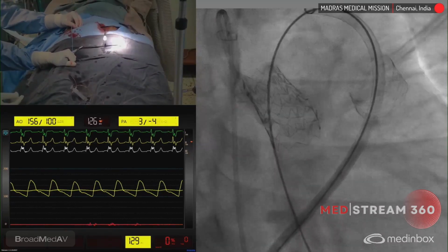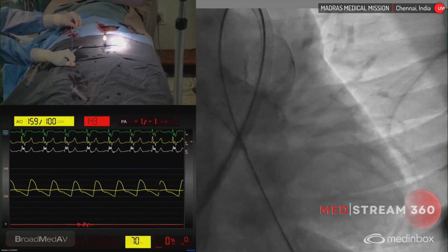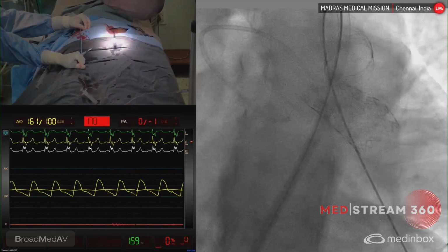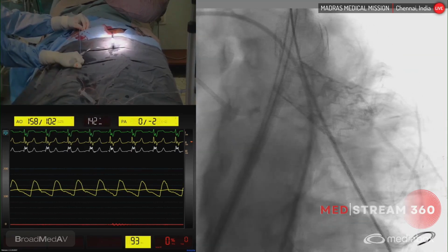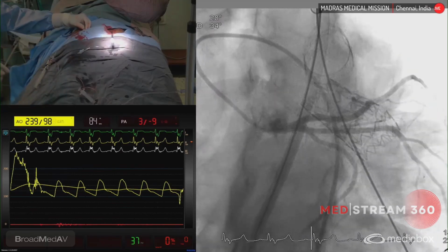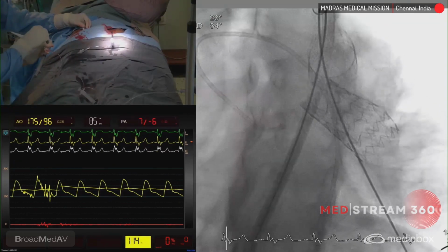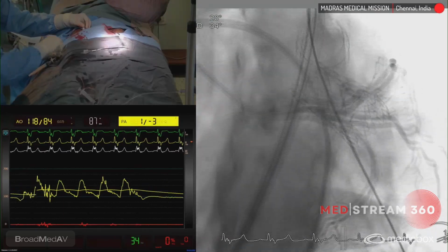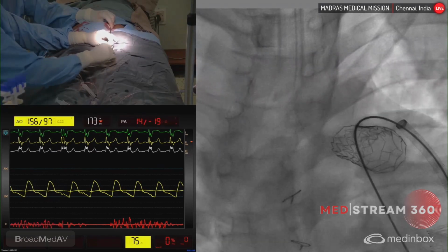Yeah, go levo. Correct. More caudal. Yes, correct. So the main pulmonary artery stent is becoming like a circle. And at this point, I'm giving one left coronary. So the left coronary artery is far away from the stent. And hence, I think there is no major concern about the coronary getting squeezed by expanding this main pulmonary artery stent. So what are the balloons you prefer for post dilatation in these kind of cases, sir?